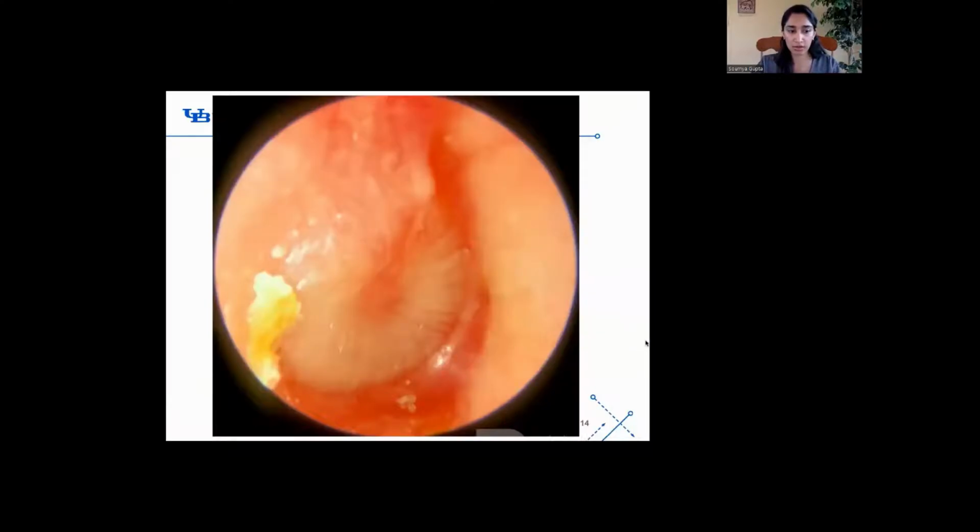So case one, a 1-year-old patient is brought to the ED with a 5-day history of irritability, and her father says she's been tugging at her ear constantly over the past few days. She has a low-grade fever. Her father mentions that several family members living with the patient have had a cold within the past week. So I know I started off with a pretty difficult one, but can anyone tell me which ear we're looking at, right or left?